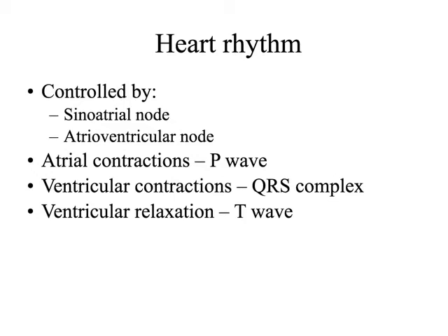When you think about how x-rays are produced and all the complex mechanical things that have to go on, as well as the computational stuff that's going on, there's no computers fast enough to actually purely gate. I can give it, here's a timing protocol, now run with it, right? Versus something like a radiation therapy machine that's doing respiratory gating.